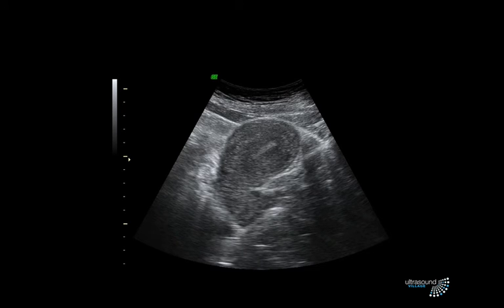Now, here is the longitudinal with an empty bladder, and you can imagine if we take a longitudinal shot through that, we get a slightly different slice of the uterus. It'll still look round with endometrial slice here, but then you go up underneath the uterus and then you go through the cervix. So you might see a round thing here, a little bit of bright stuff here, and then slice the cervix here and then bowel gas behind. Let's see what exactly that image in transverse gives us.